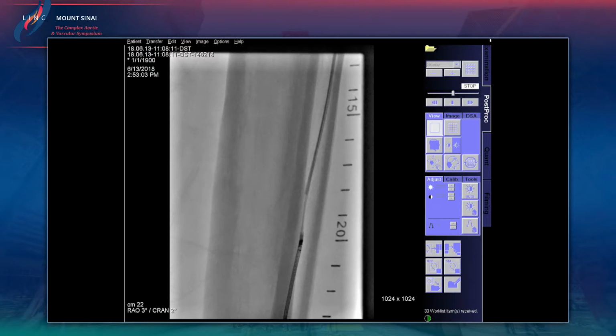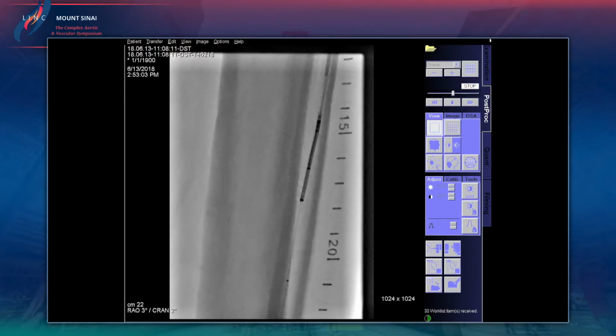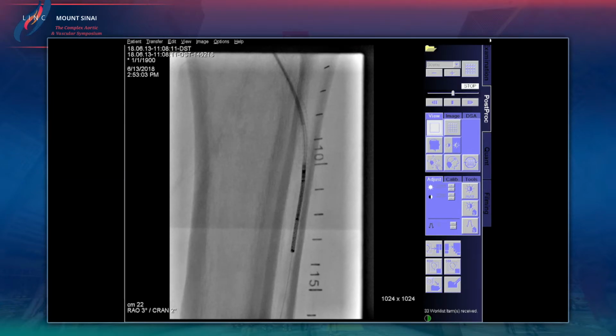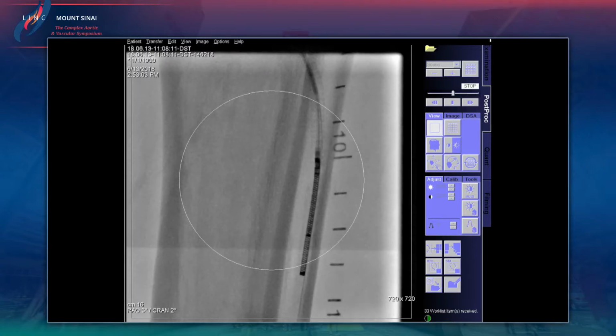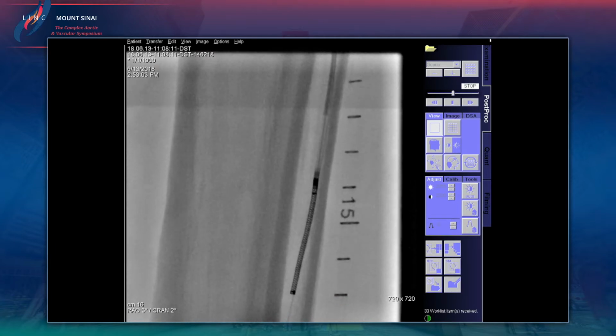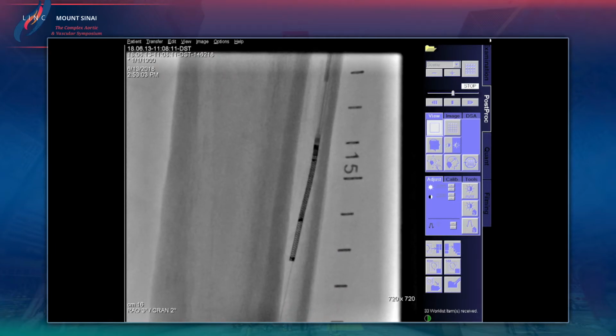Is that an SXC? It's an SXE. It's very aggressive, as you know, Brian. I know that everybody wants more aggressive cutters, but I get very wary when they're so aggressive below the knee. Especially mag up, please, at this area. Yep, go now. Yep, that's good, go. So I try to do two passes, one in each zone and one in each angle. And when there's rotation of the cutter, I try to rotate it back into the medial plane where I want to look at it.